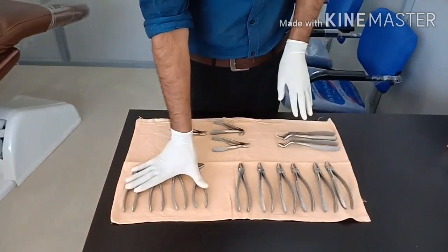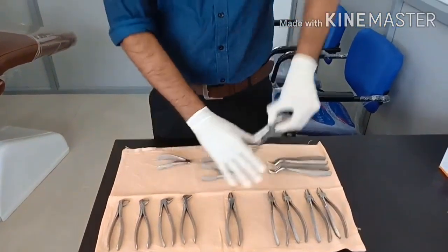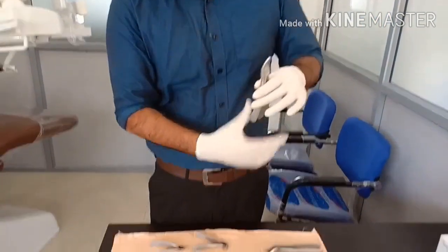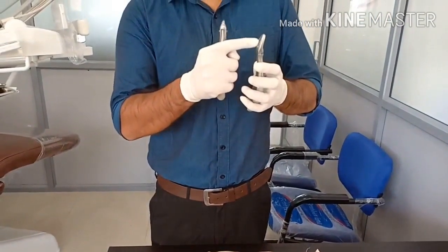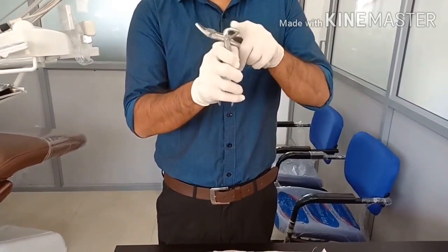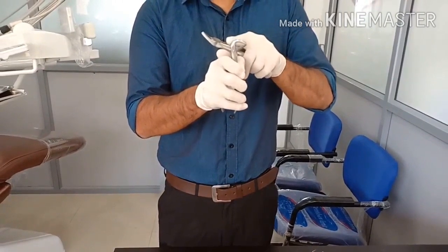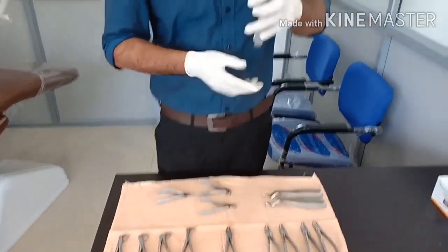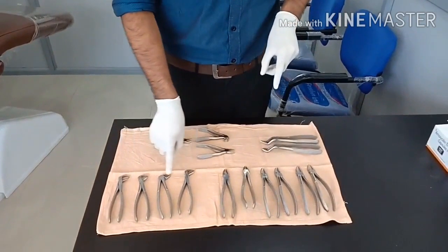The basic difference between the lower jaw or mandibular forceps and the upper jaw forceps is the angulation between the hinge joint and the beaks. You can clearly see the hinge joint and beaks are almost at a straight angle on upper jaw forceps, whereas on lower jaw forceps there is a 90-degree angulation.